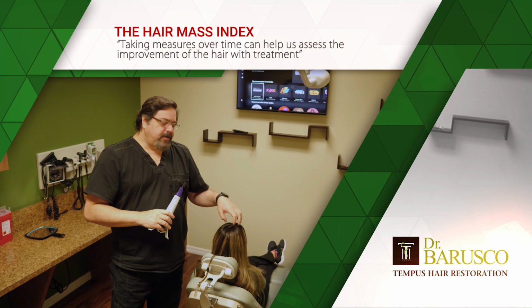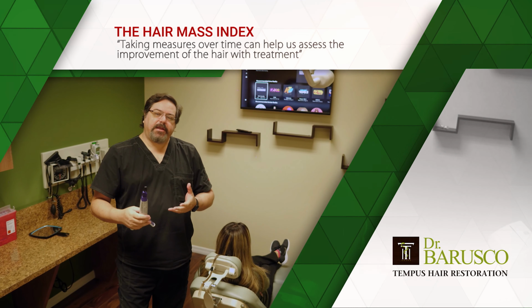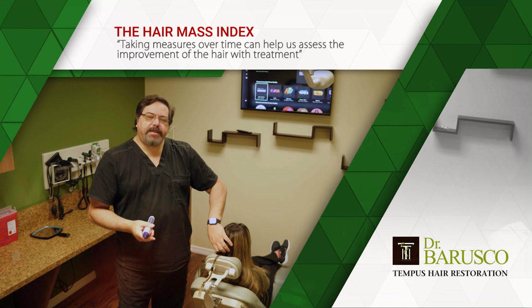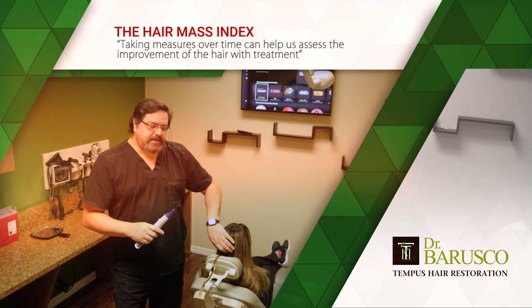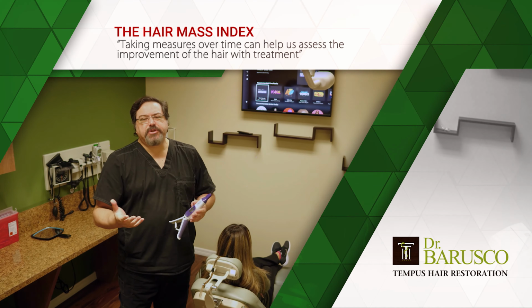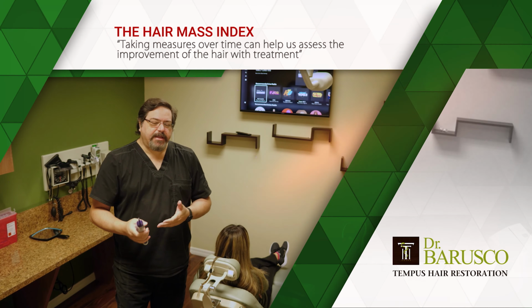So we measured an area here on the top. That's where the hair loss is occurring. We always also do a measurement of the thickest hair, which is usually around the sides and back. That's what we call the donor zone of hair, where the hairs are not supposed to get miniaturized or get thinner.